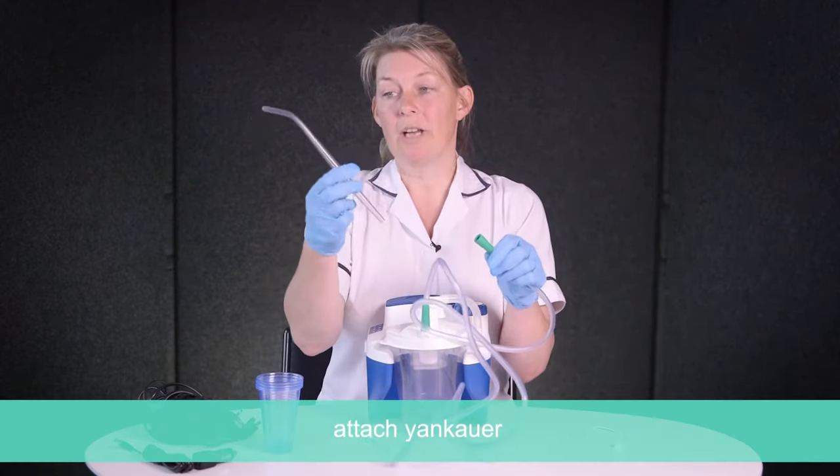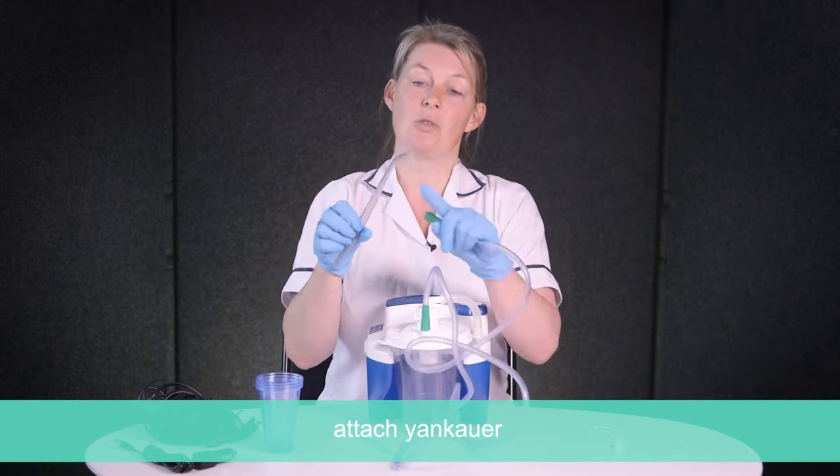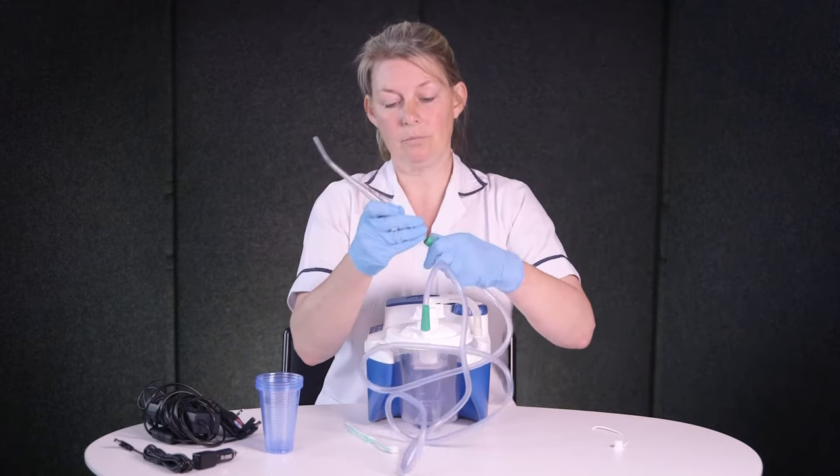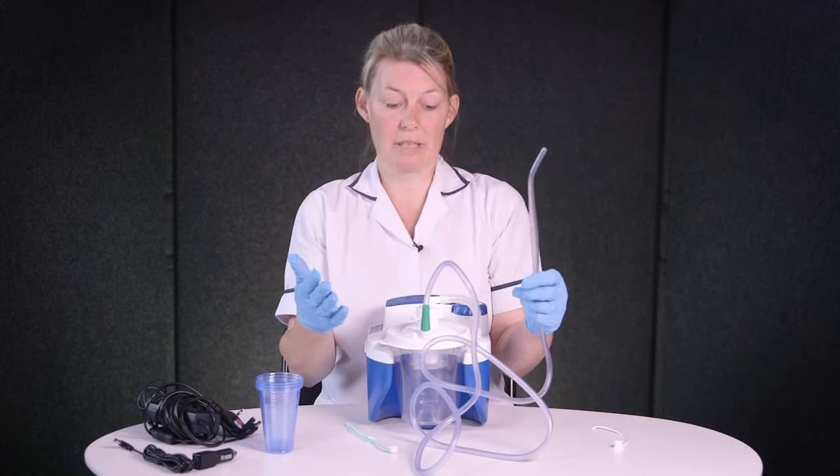On the end we're going to use a Yankauer, similar to what you see the dentist use — it's just a hard tube with some holes at the back. So that's it set up and ready to go.